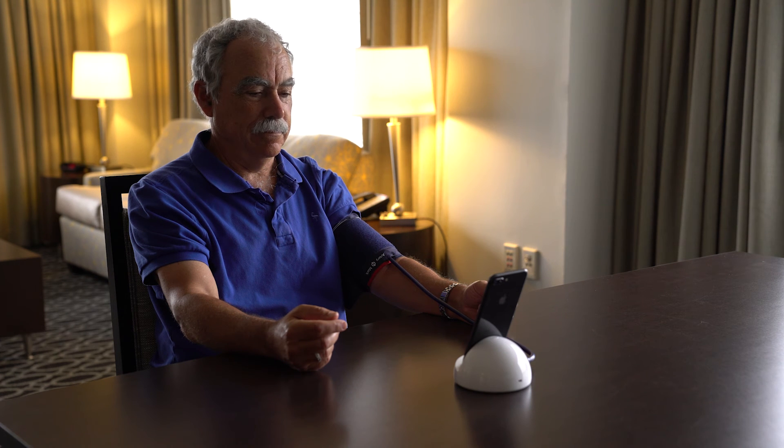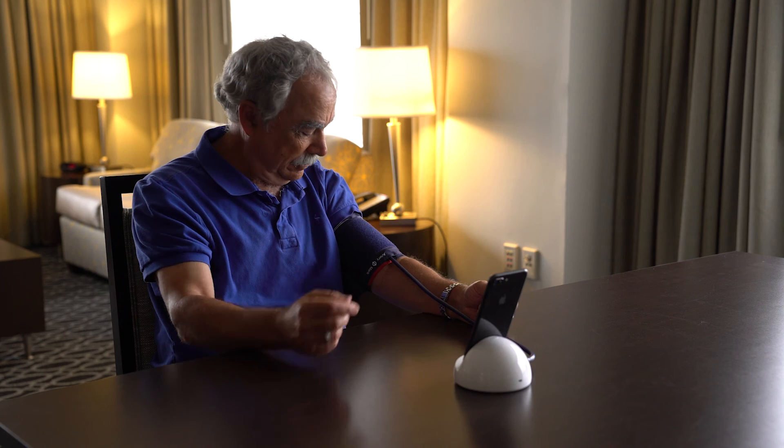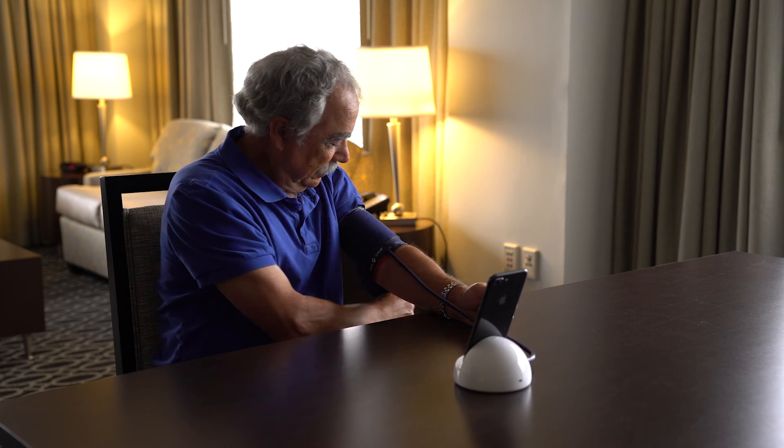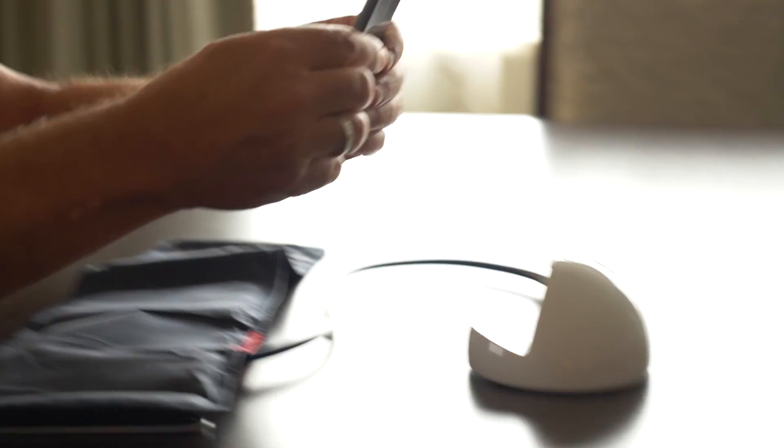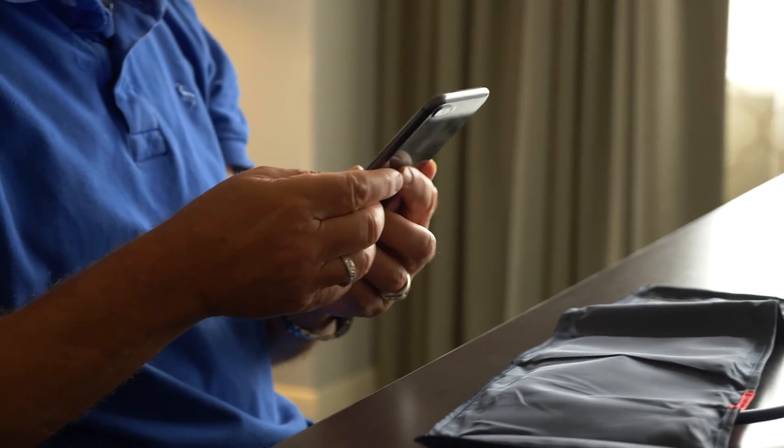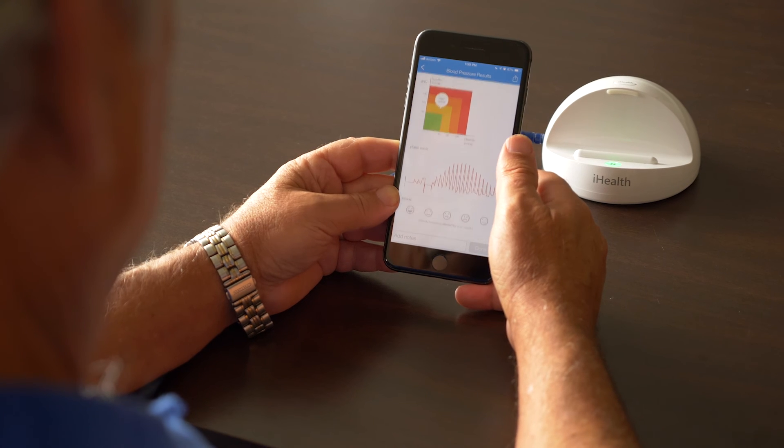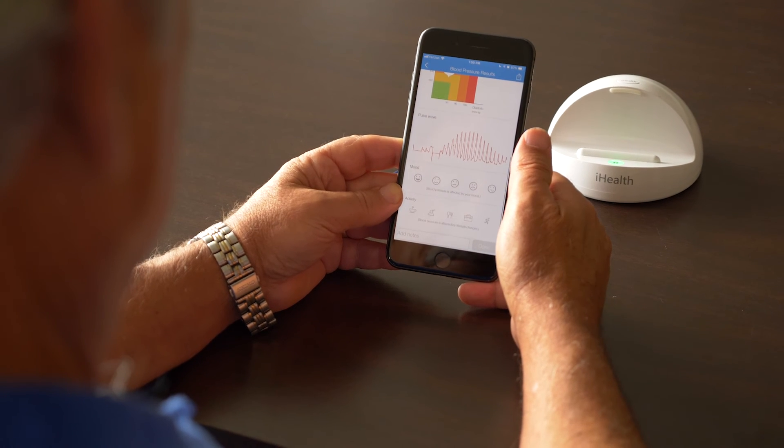When the reading is complete, results will be viewable in the application on your smartphone and will also be automatically sent to your Ochsner medical record where it will be viewed by your care team.